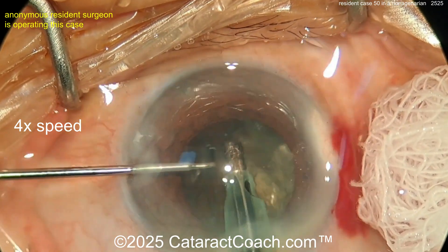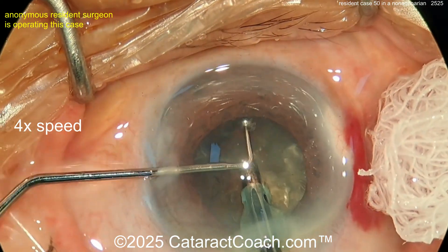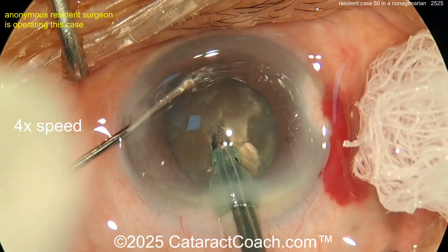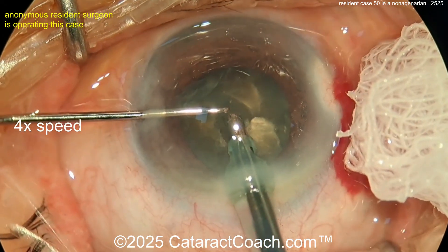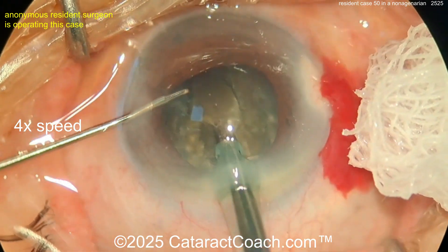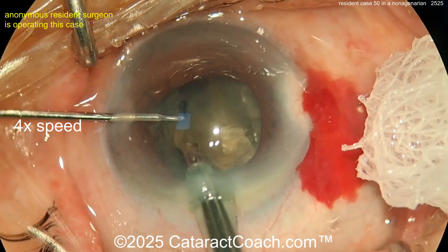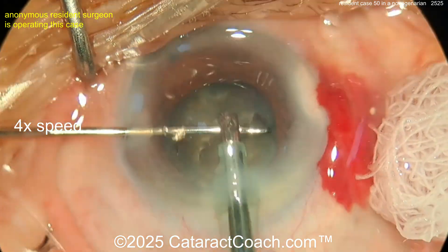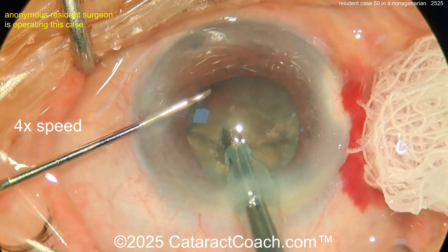The surgeon is struggling a little bit with fluid on the surface, and keep in mind the video is sped up to 4x. Buzzing with the phaco probe — get a purchase on it, get that chopper going around. For case 50 this is okay; it takes some time to learn. A case like this — I would tell you maybe you're better off doing a stop-and-chop, debulking a little bit more. I want the Purkinje light to stay in the center of the cornea throughout the entire case.